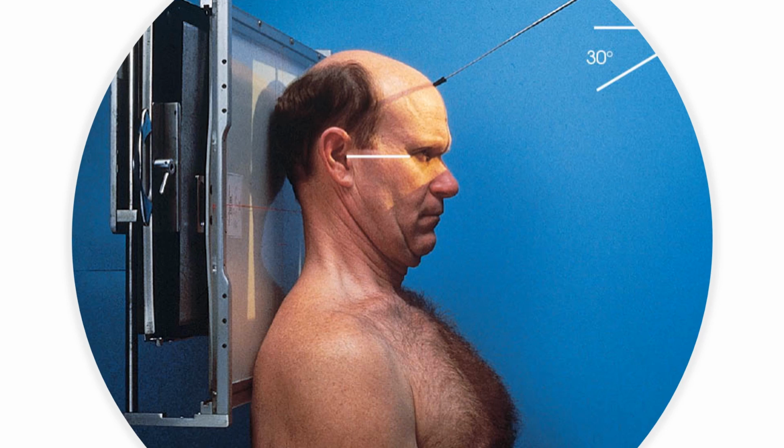All right, so this, yes, good, I have it. So the orbital meatal line, you're going to have to tuck the patient's chin, the orbital meatal line perpendicular to your image receptor, and then direct your central ray at a 30-degree down angle, 2.5 inches superior to the glabella. And what you should find, see how the black line kind of wraps around the patient's head? It should pass over the top of the ear attachment and exit the base of the skull.